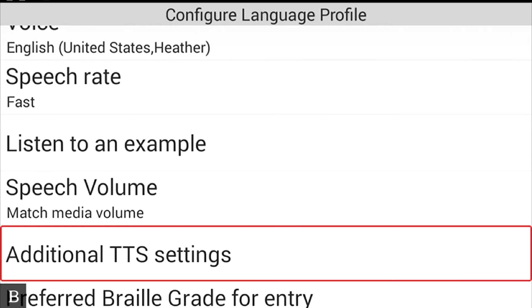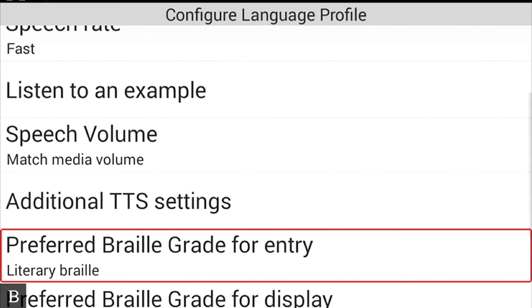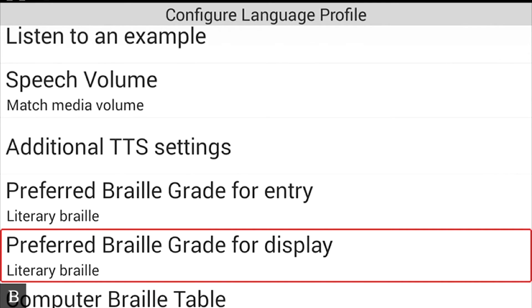Additional TTS Settings allows you — if you downloaded Eloquence or another text-to-speech voice — to configure it using its own custom settings panel, as some engines have more options to configure. Next is 'Preferred Braille Grade for Entry,' currently set to literary Braille, and 'Preferred Braille Grade for Display,' also set to literary Braille. You can have computer Braille for entry and literary Braille for display if you prefer different options for each.